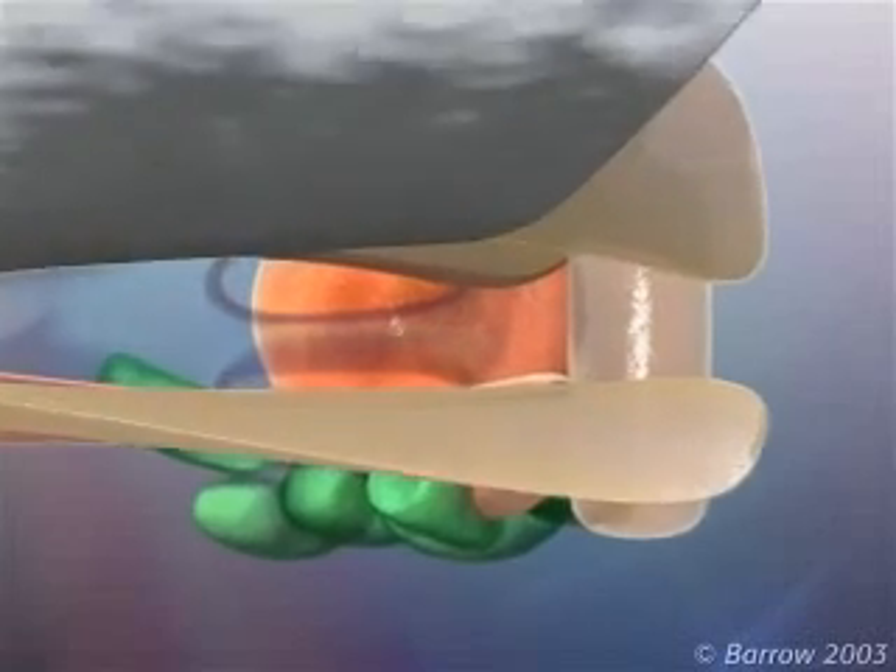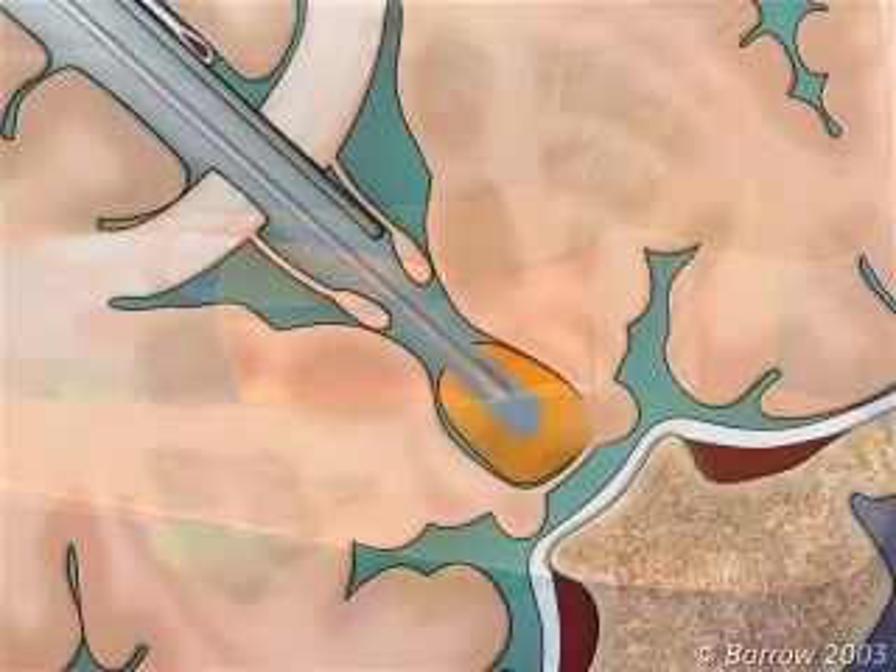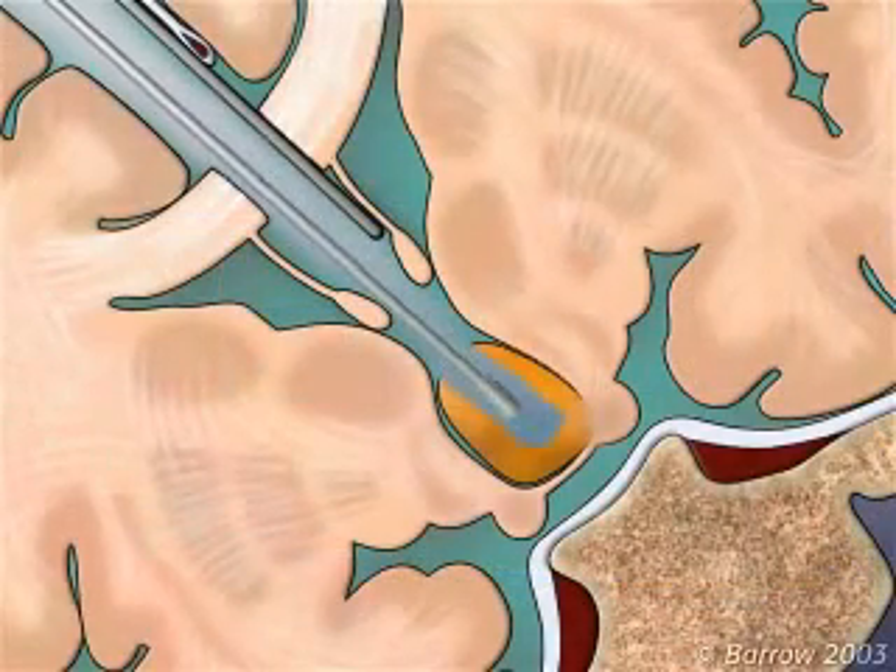Once the third ventricle is entered, the hypothalamic hamartoma is visualized beneath the ependymal surface bulging into the third ventricle. The hamartoma is carefully removed by suction.